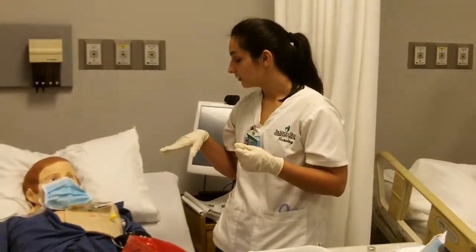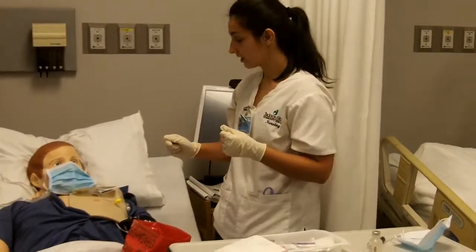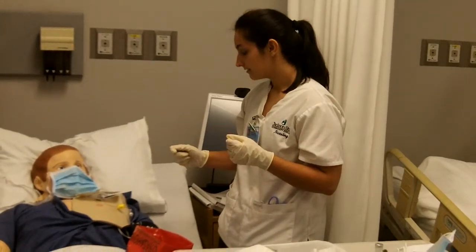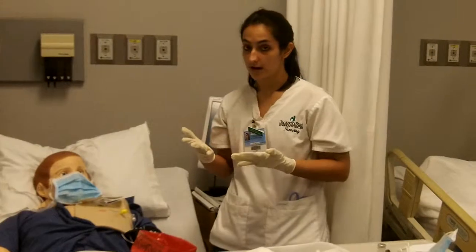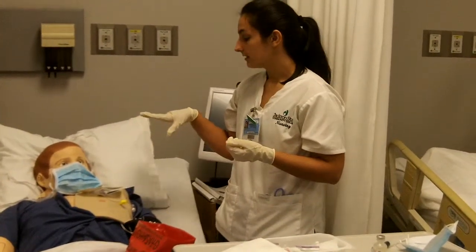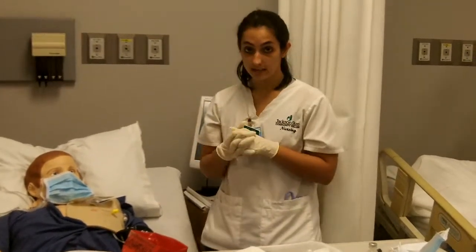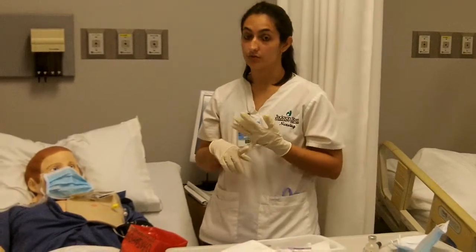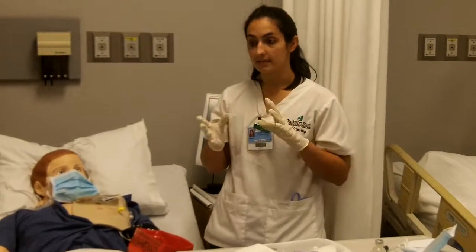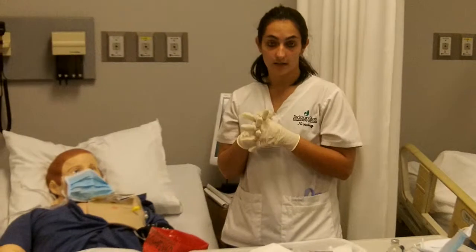And then I would use the chlorhexidine scrub, and I would use friction, and I would do that for 60 to 90 seconds. And then after that would dry, I would replace a dressing on top with my initials, date, and time. And whenever I documented, I would say that I used sterile technique, the site and how it looked, if there was any drainage, things like that.